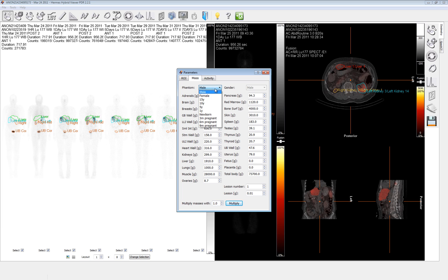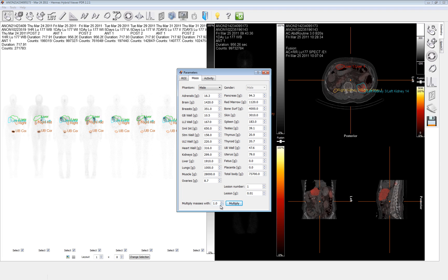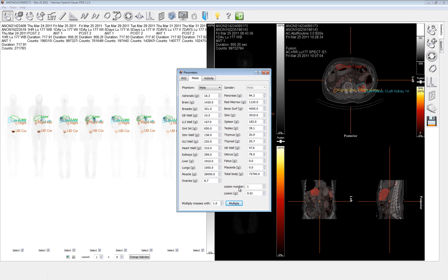As we've got a SPECT CT they're a little bit less useful. The next page lets us choose our phantom, this does happen to be a male, and choose a weight for each of the organs. These are the standard MIRD man weights for all of the organs as they stand. There's a tendency for people to multiply the total weight in order to get the patient's weight and I urge you to reconsider this as largely what you're doing is multiplying all of the organs by a multiplicative factor, when in fact most of the time it's the addition of extra muscle and adipose tissue, which don't really affect the dosimetry that much.